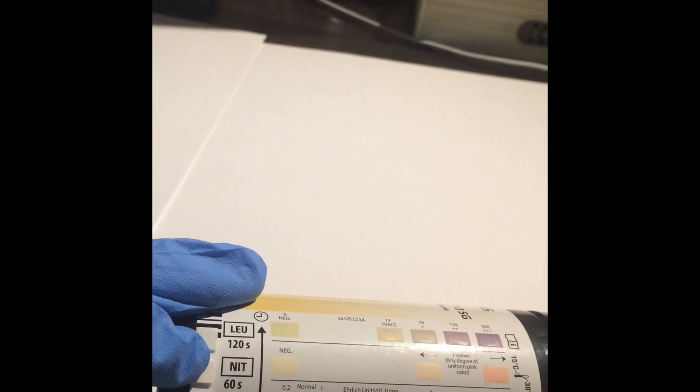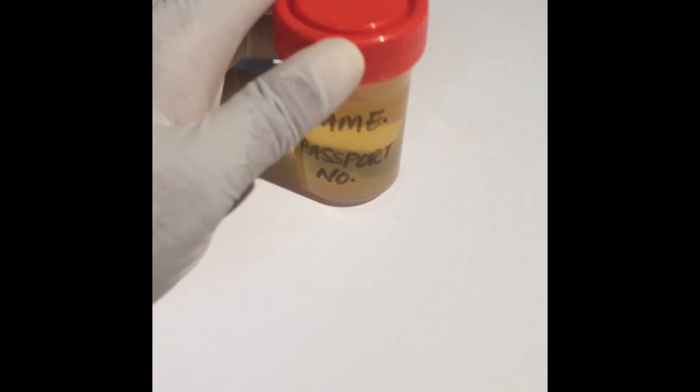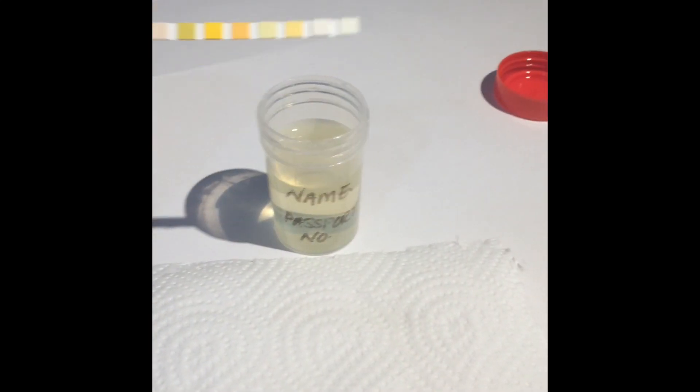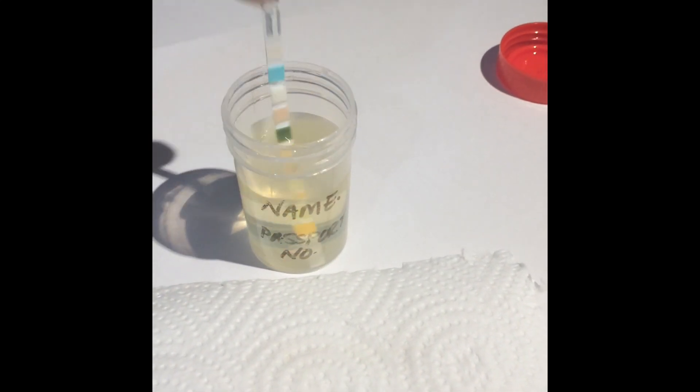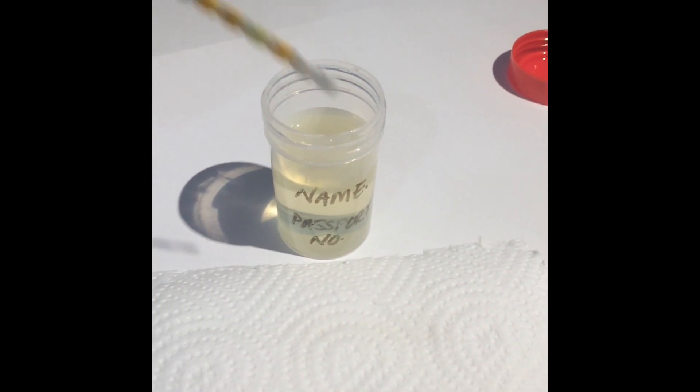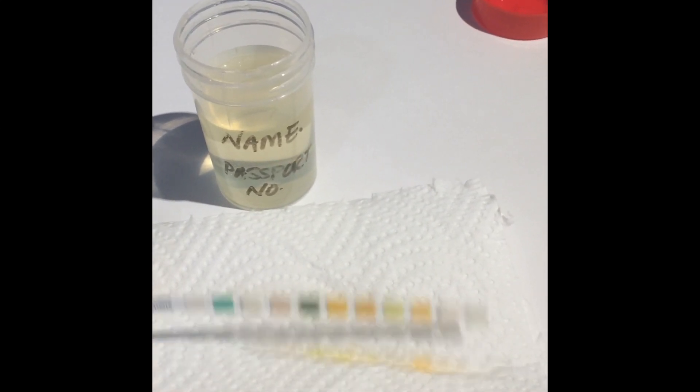Here is how to do the test. Ensure the two identifiers are correct: name and date of birth. Then mix the sample by inversion. Dip the dipstick in the sample till all the squares have touched the urine and dab out the excess urine on a paper towel or gauze.